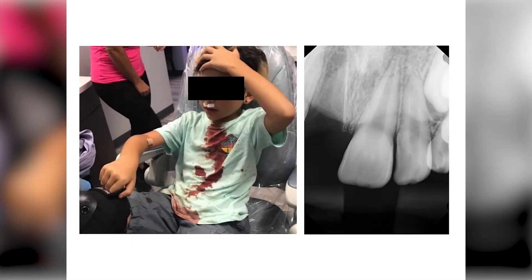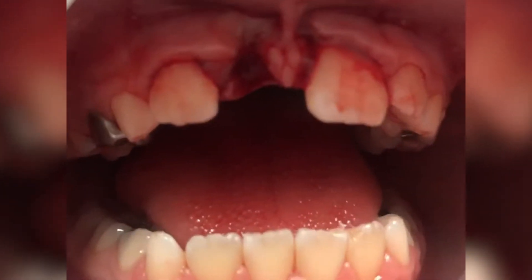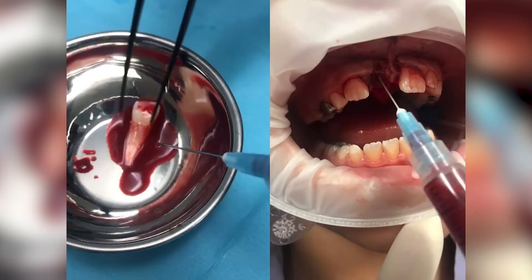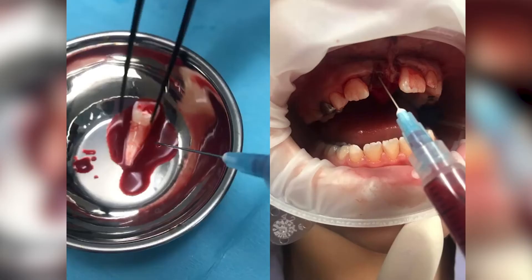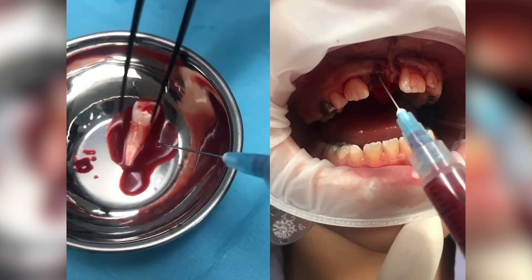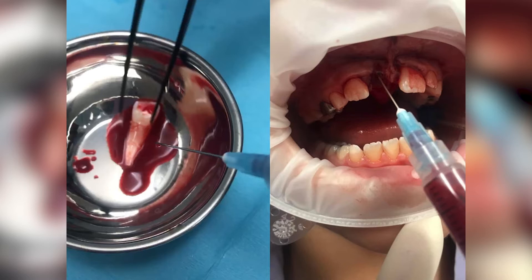A ten-year-old boy presents with an avulsed number eight after a skateboarding accident. Here you will see the application of liquid PRF to the external root structure, as well as directly into the socket. PRF will promote the proliferation, migration, and differentiation of stem cells from the apical papilla, as well as increase cell viability of the PDL cells.